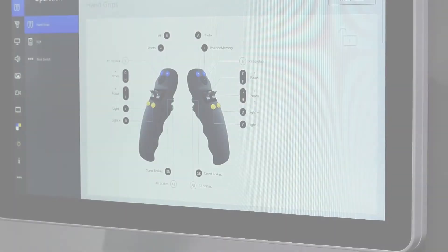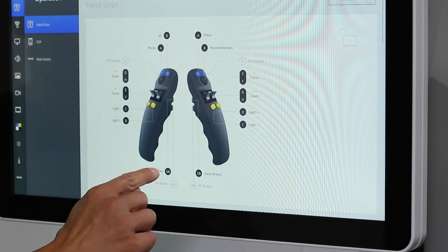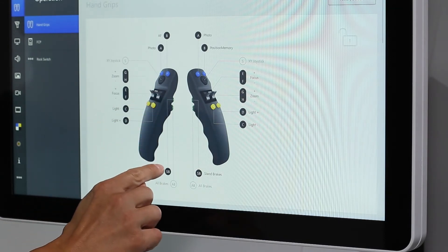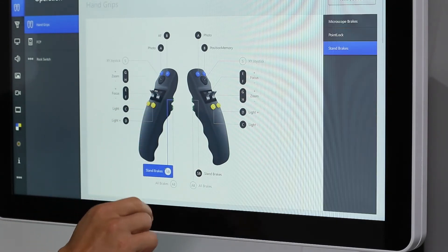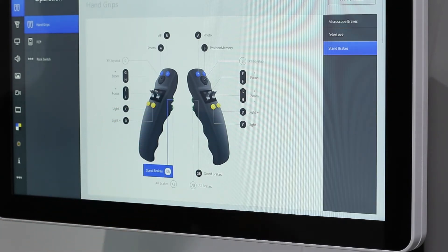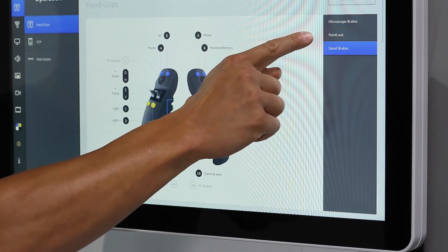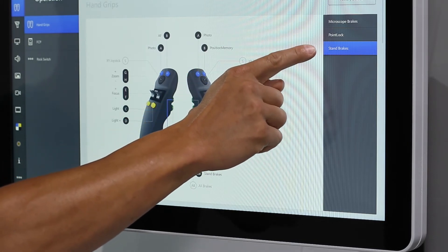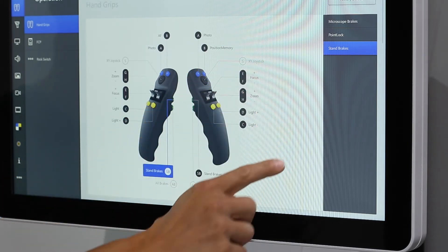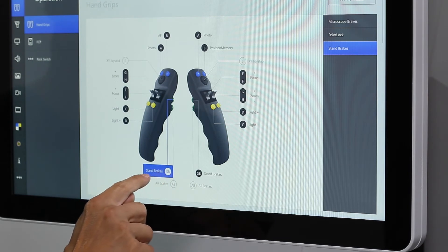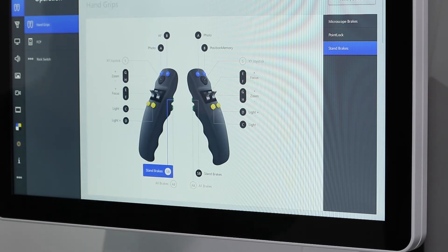The upper green button on both handgrips offers additional movement possibilities: microscope brakes, point lock, and stand brakes. This button is configured for stand brakes.